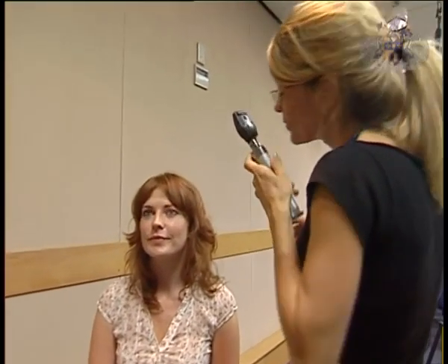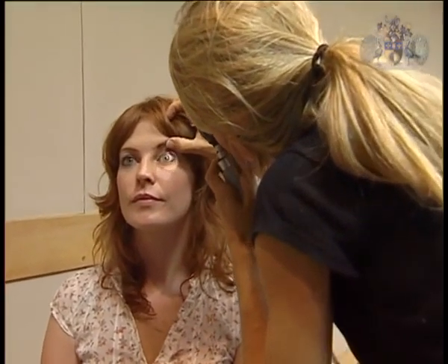Examining the patient's left eye. Alright, thank you. May I have the patient's left eye? Stand on the left side, with the ophthalmoscope in your left hand to your left eye. This often requires a lot of practice, but you will need to demonstrate this technique.